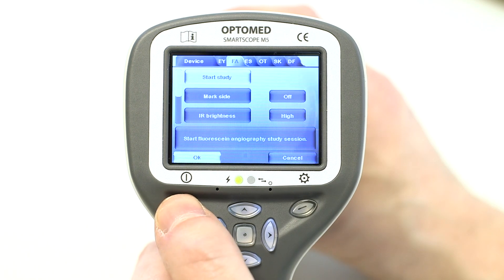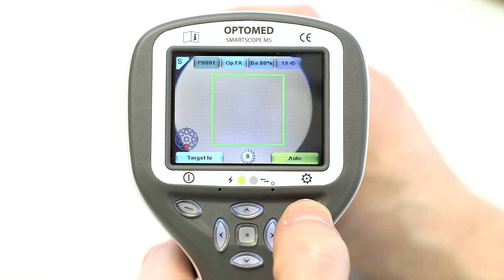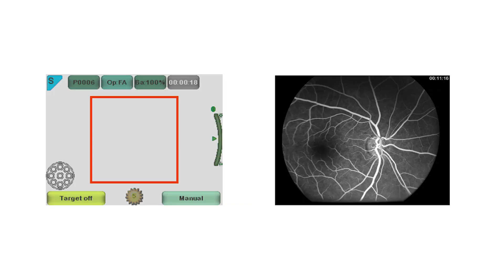For every new study, the user needs to go into the menu and select start study to enable the time counter. To access the menu, press the right soft key. The time counter appears on the upper right corner of the live view screen.